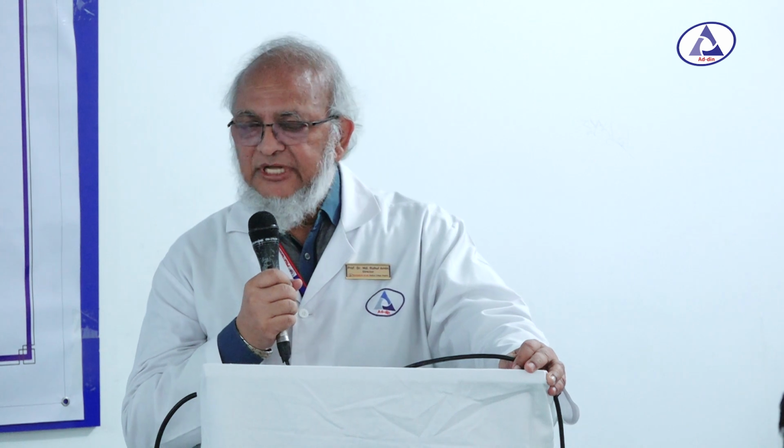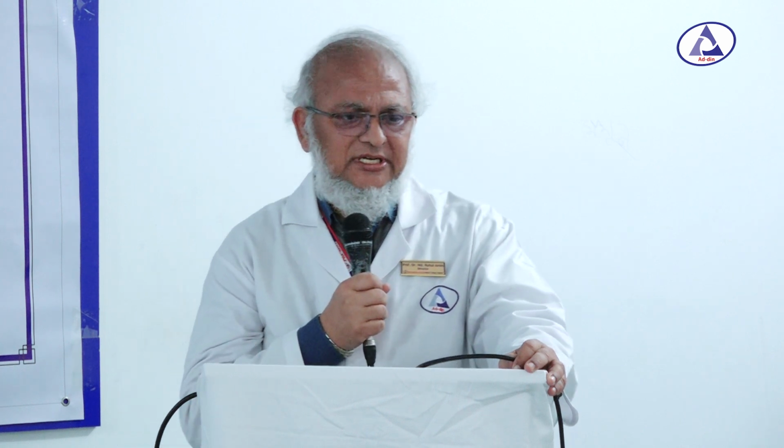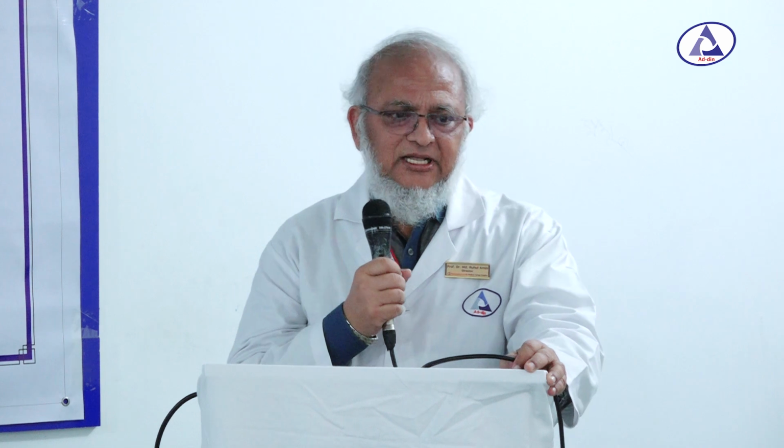intraocular lens. And there is a board that I can show you. I shortened the lens by cutting the haptics. Then I put it on the iris. That is an iris fixation lens. I made it an iris fixation lens because I had no lens at hand. I made it an iris fixation lens and placed it in the chamber.